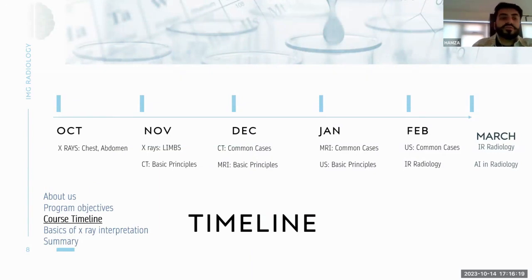Next session, we're going to be talking in more detail about chest and abdominal X-rays and basic interpretations. Following that, in November, we'll be moving on to limb X-rays, which, especially if you work in emergency medicine, you'll see very commonly. Before you refer to orthopedics, you will be expected to know what the X-ray shows, or at least have an idea of what you're looking for.